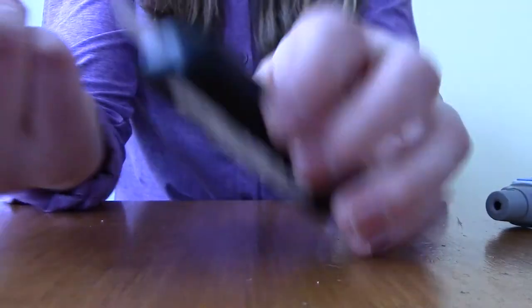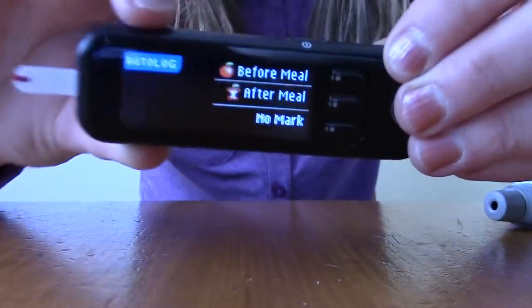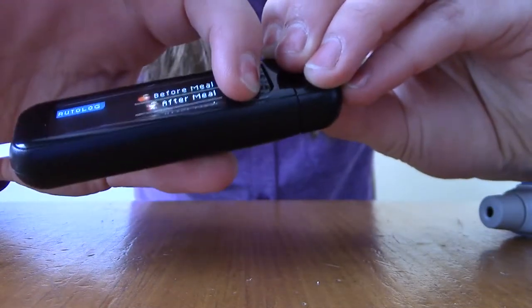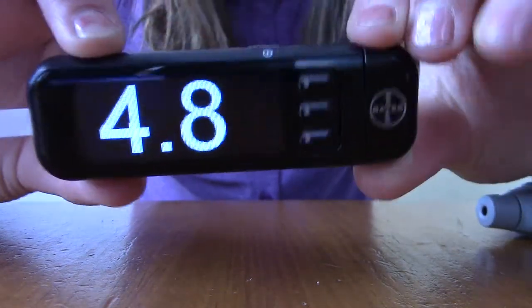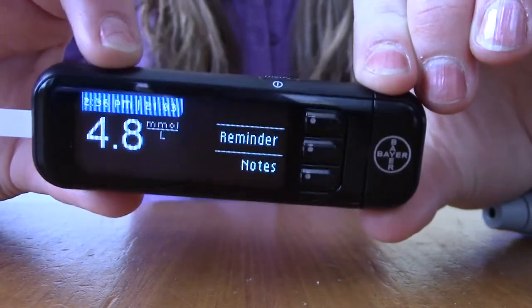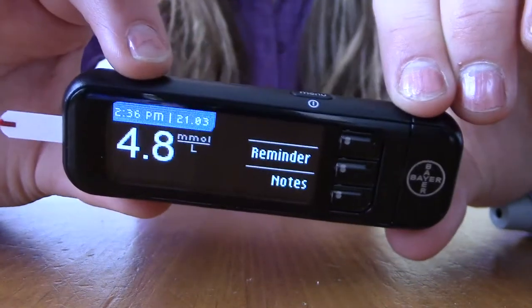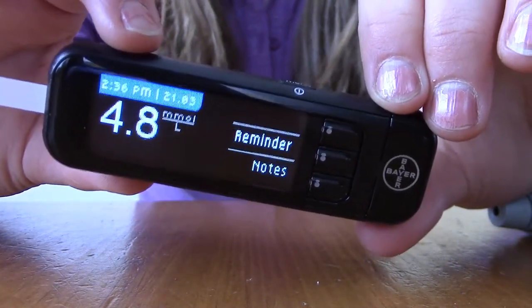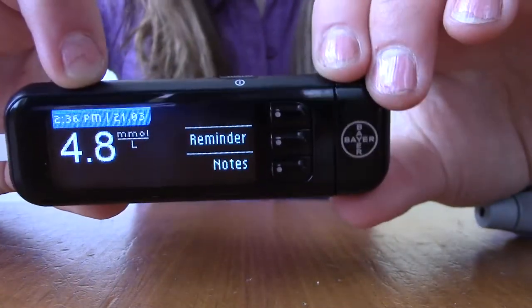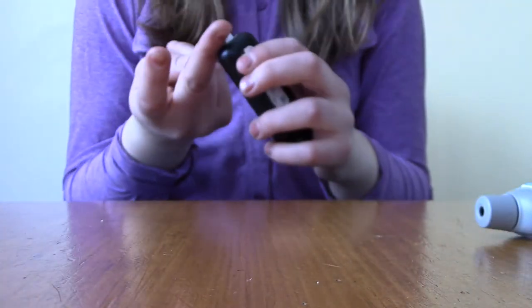Alright, now I'm gonna apply that blood onto my meter. Now I can choose from a couple of different selections. I'm just gonna choose 'no mark' because I'm not about to eat and it's not after a meal. Oh my gosh, look at that! I'm at a perfect 4.8. That is a beautiful blood sugar level. This is millimoles per liter. Keep in mind this is not milligrams per deciliter like they measure in the States. This is actually a fantastic number, so I'm really happy with that.